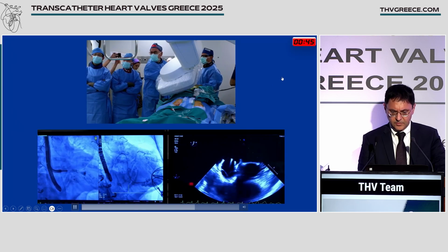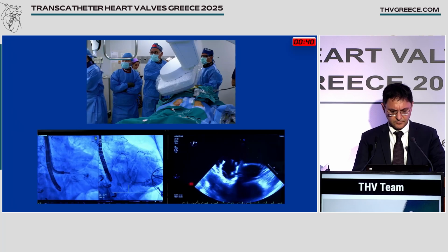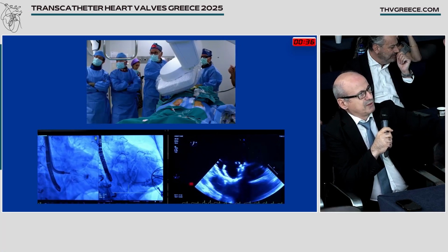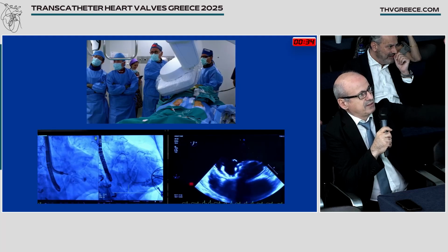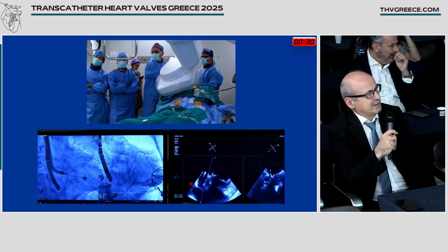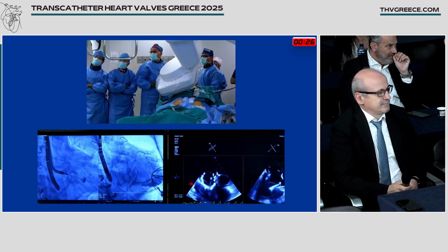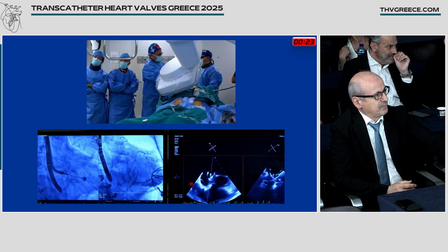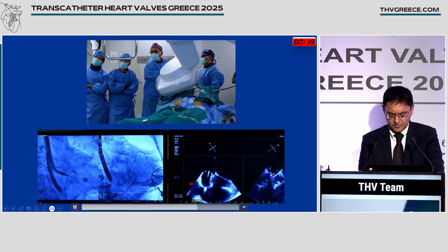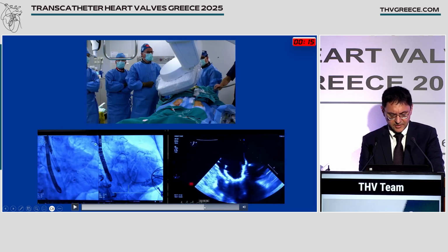And then you have to reverse all the manipulation you did earlier. You see how we straighten the capsule to make sure that we're coaxial with a tab that is still in the ventricle, and we pull it back slowly, and the procedure is finished. Retracting the system.